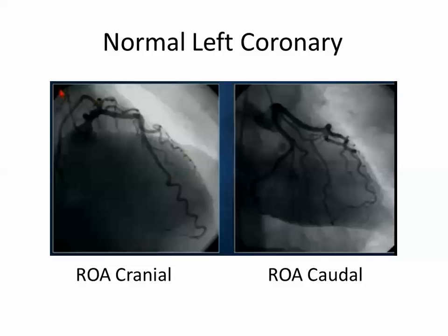If I am taking the image from cranial, I will see the mid and distal segments of the vessel and see the diaphragm. It's clear? So this is caudal or cranial? This is the diaphragm, so it's cranial. So it is RAO cranial. No difference for us, cranial from caudal. It's the same walls. It's just a different view to see which vessels will appear more.